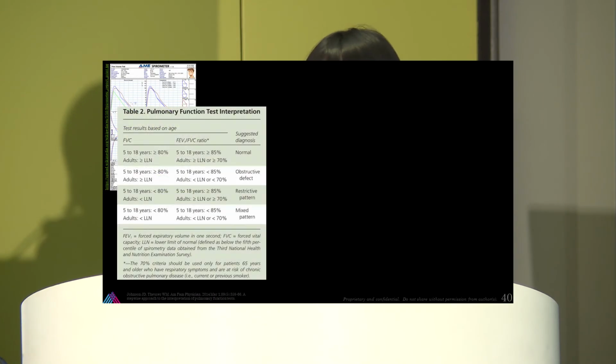And in the end, it gives you, say, 70% FEV1, which really, again, tells you global lung function. It doesn't tell you that one part of your lung is very healthy and another part is not as healthy. And it takes 1 hour to complete, so 3 different times you're going to have to go for an hour and do this exam. I'm showing this very little on purpose because it is a very complicated graph to analyze, and I'm not a pulmonologist, so I'm not going to do that too much, but I just wanted to highlight how complicated that result will be.